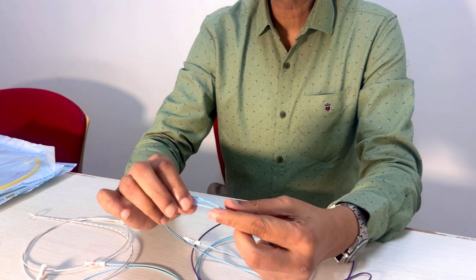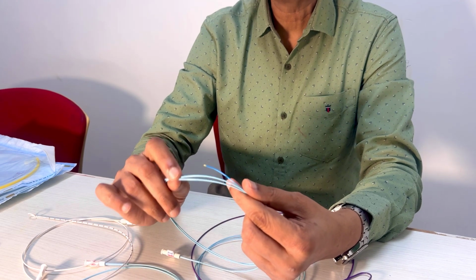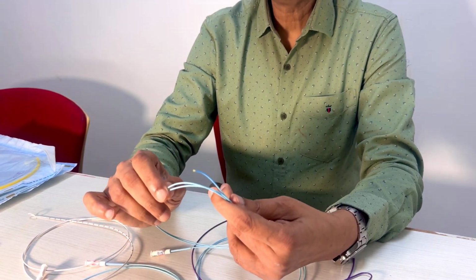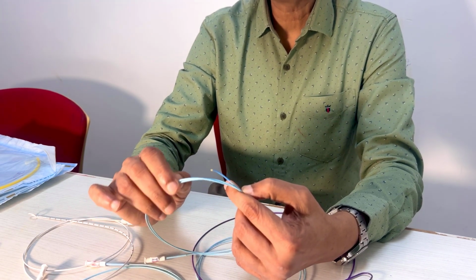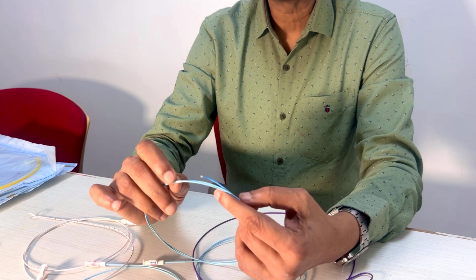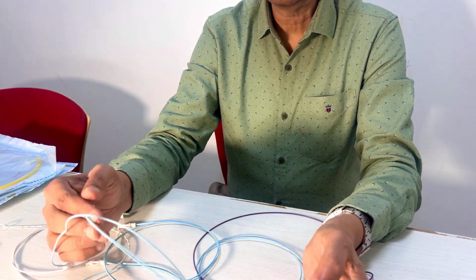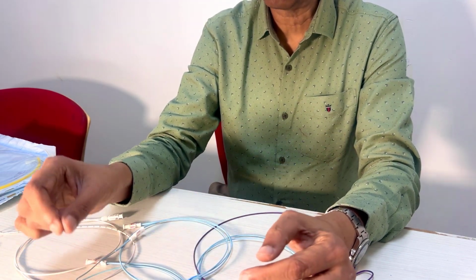So even if they twist and tangle and get knotted, they don't break, which is a very, very important factor. Why is it important? Because basically, when you're doing a case, you can retrieve these catheters if you're smart. Having said that, I'll just quickly tell you how to retrieve a catheter. Not really part of the class, but since I told you this, I'll make you understand what happens.